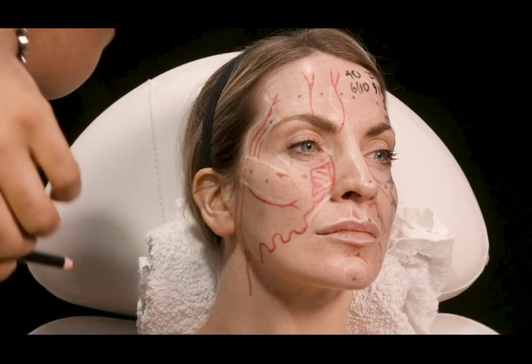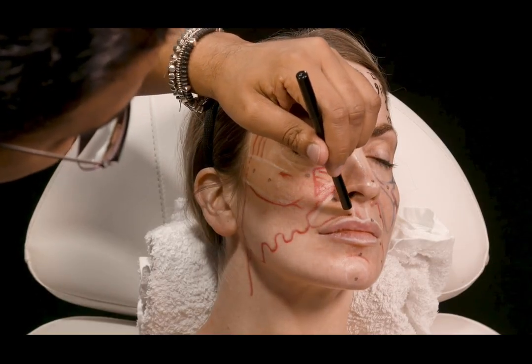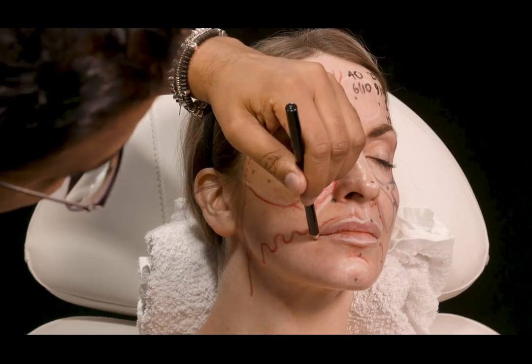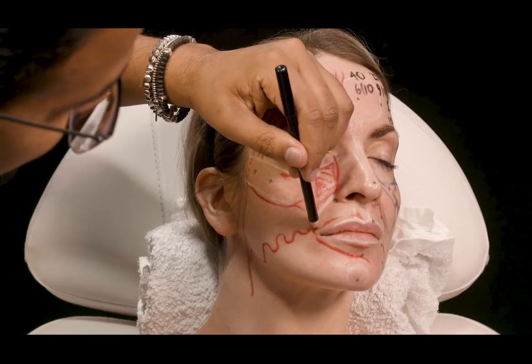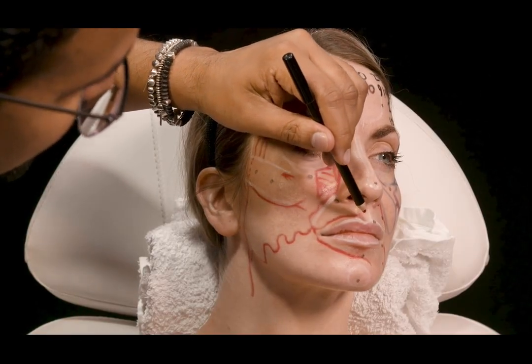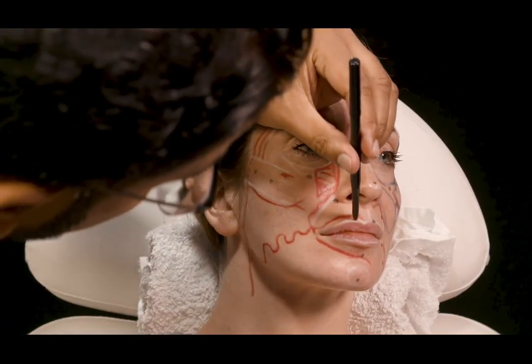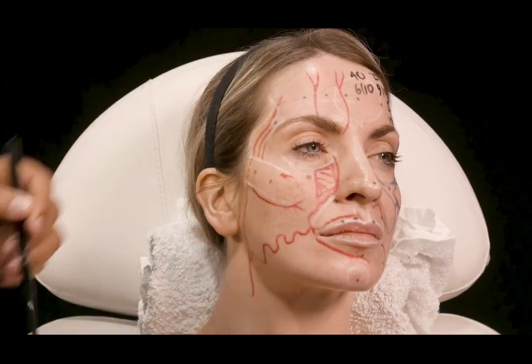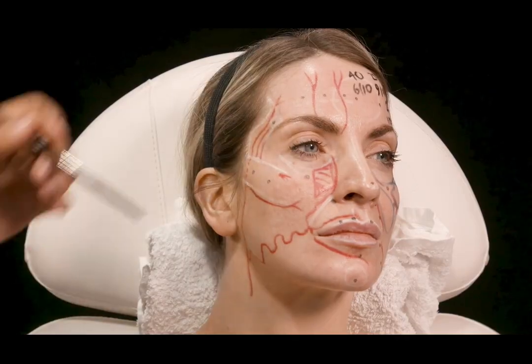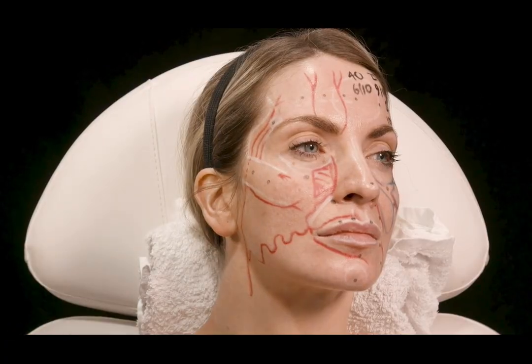When we do her lips, we are going to do a safe injection, which is above the level of the superior and inferior labial arteries. Now, those arteries are running underneath the orbicularis oris muscle. So when we're doing her lip, here and here, the depth of this injection must be subcutaneous or submucosal. If you go through the muscle here, you've got a vascular risk and you may have an occlusion. You certainly have a bruise, ecchymosis, or even hematoma.